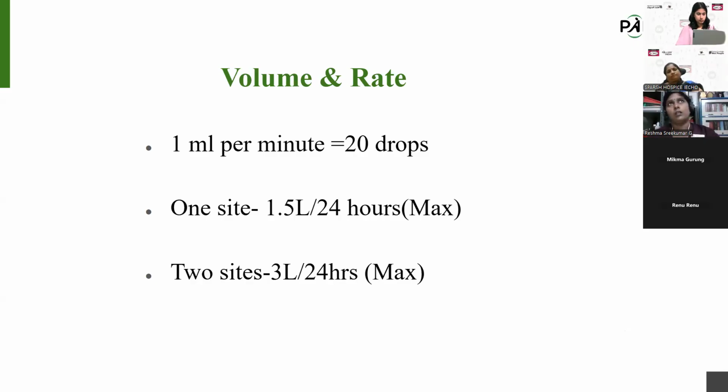If we are giving fluid or medicines, anything, the volume and rate is this, we can only give 20 drops per minute. If we are giving more than 20 drops in a minute, the patient may experience severe pain, or here we are introducing the medicine to the subcutaneous space, and there is a chance of leaking if there is an overload. So please keep in mind, we are only giving 20 drops per minute.